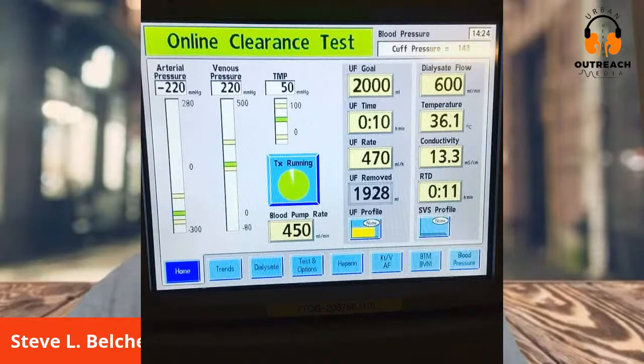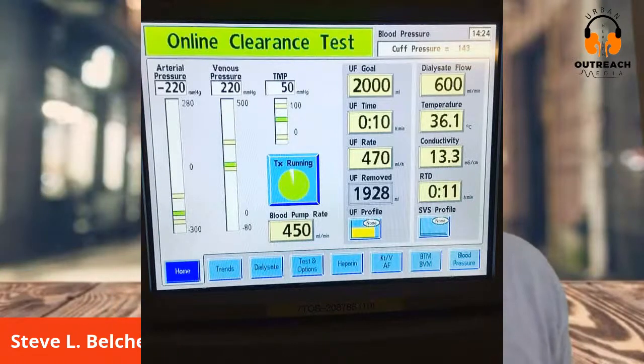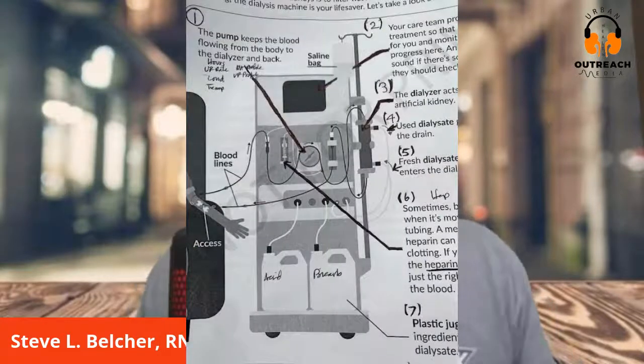The venous pressure over to the left is monitoring the pressure in the venous needle or the venous line, so that pressure is going to go up, and the arterial pressure monitors the arterial needle. All right. Each pressure is supposed to be between a certain range. And if you have a high pressure with your arterial site. All right. So let me move on from that screen. So now let me put this back up.